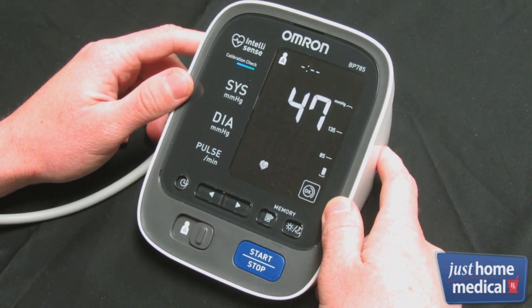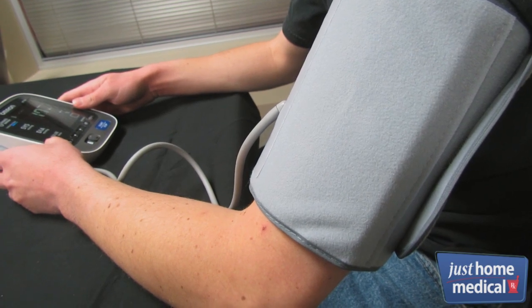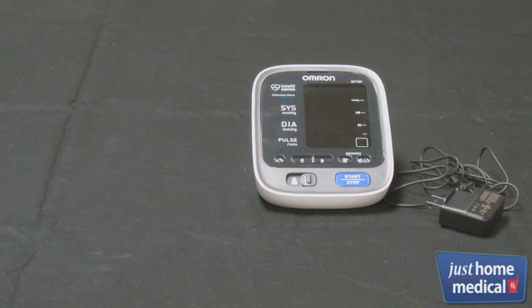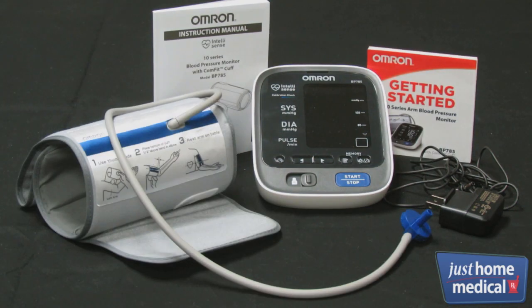The Omron 10 Series Upper Arm Blood Pressure Monitor has many advanced features to provide you with detailed health information. It comes with an AC adapter, a set of instructions, a quick start guide, and a Comfit cuff.